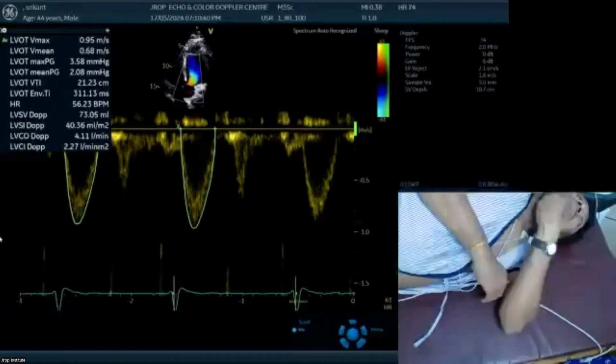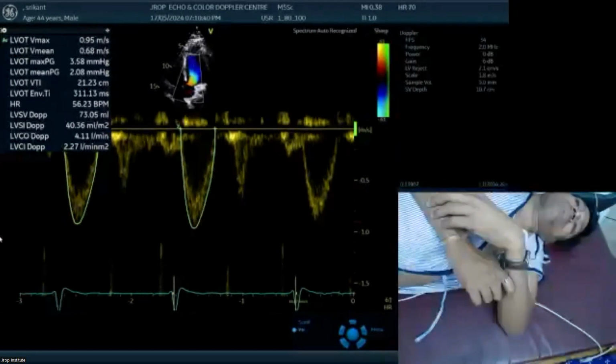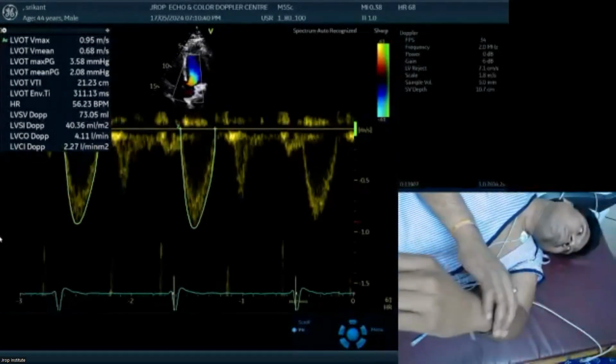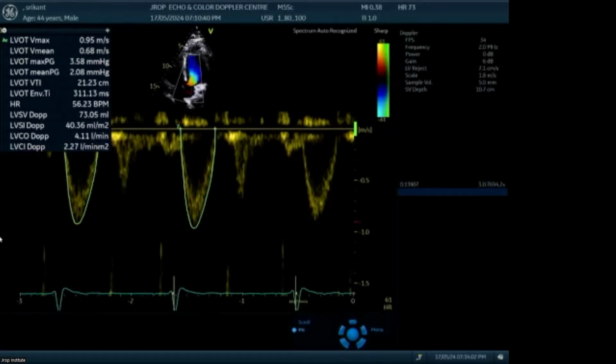It has a lot of significance when we have to decide the severity of regurgitation. When we use multiple parameters, this is one parameter we always take into practice. Look, you are at the beginning. When we have to answer whether this person has to go for replacement or repair of the valve, we have to tell them this is really severe. We can't say it appears severe, it's probably severe, it's mildly severe. Severe means severe, and the majority of parameters should corroborate before we ask the person to go for surgery.